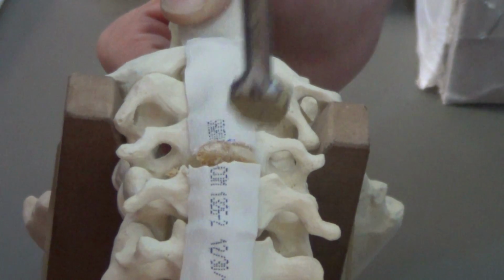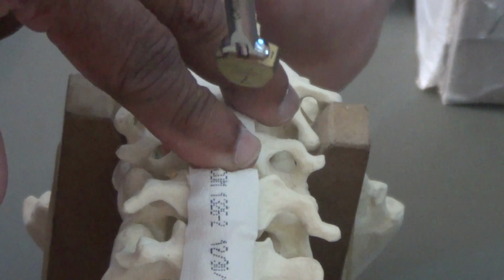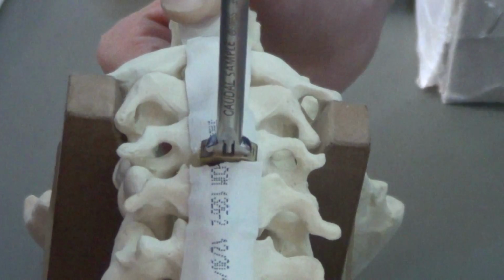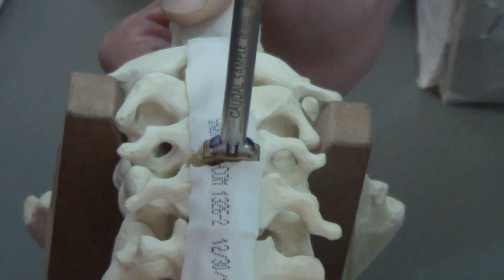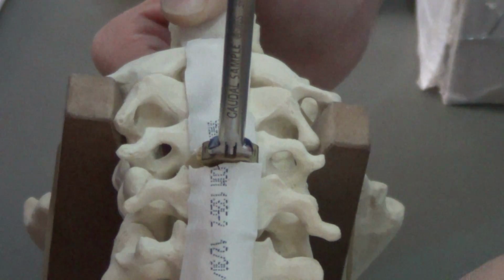So now in these, previously we did a cortical bone graft. If you put a nice fitting bone cage which is stable, when your distractions are removed, you are happy with this stability, we can just leave it, then put him on a firm hard collar till the bone unites. But nowadays we want them to start moving around early.